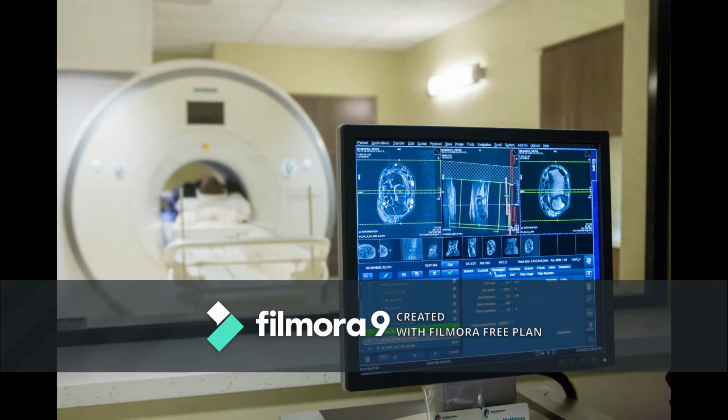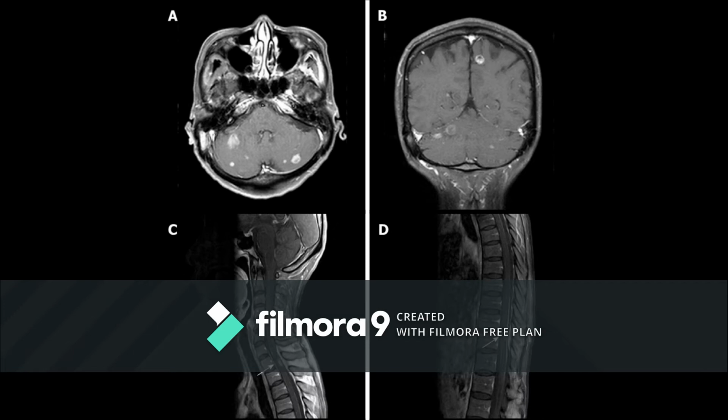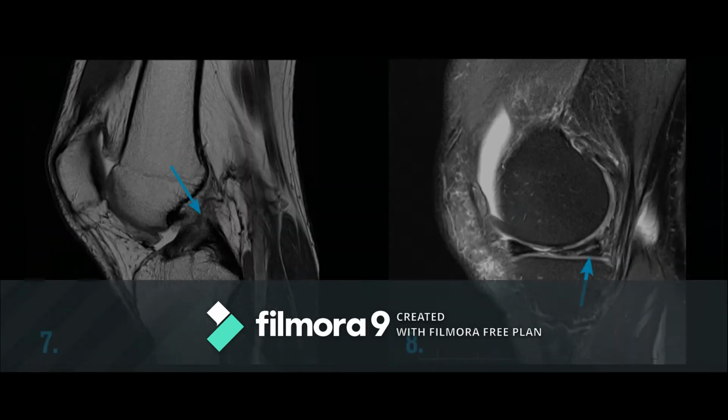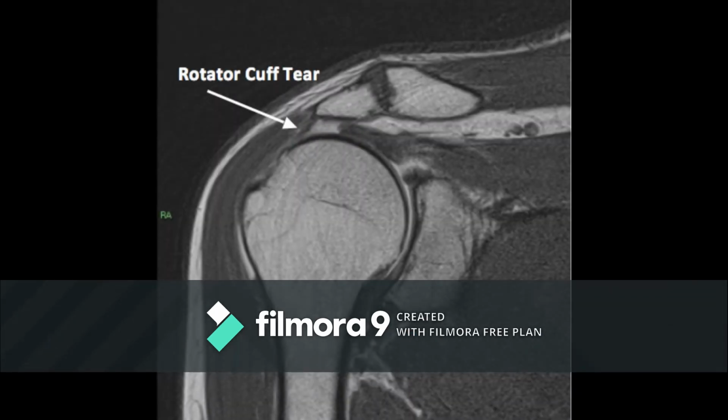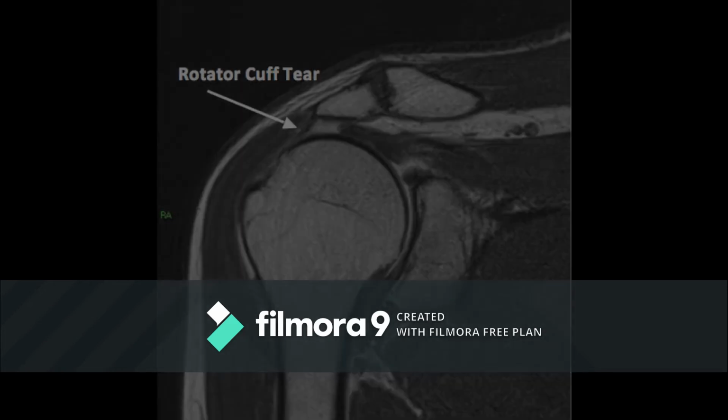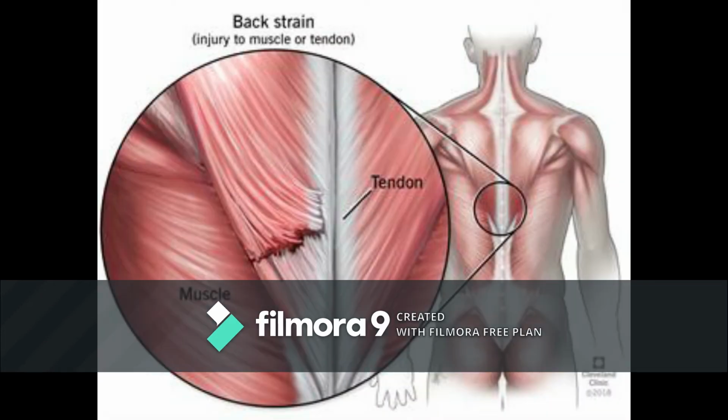MRI is commonly used for providing high-quality images of the brain and the spine. Professionals primarily use this medical technology to examine knee injuries and other sporting injuries through clear scans to identify the problems associated with soft tissues such as muscles, tendons, and ligaments.